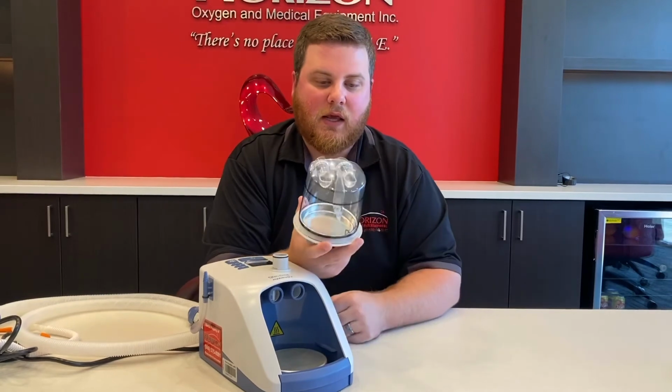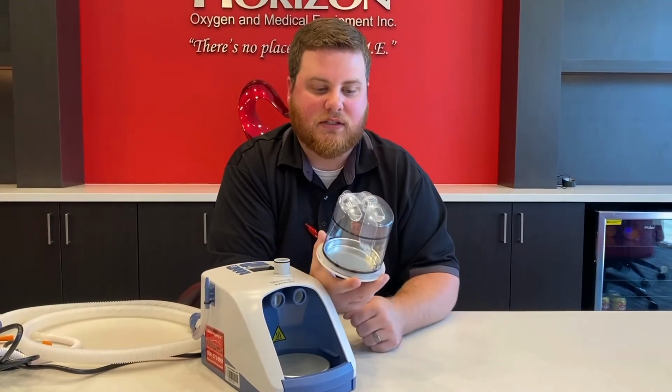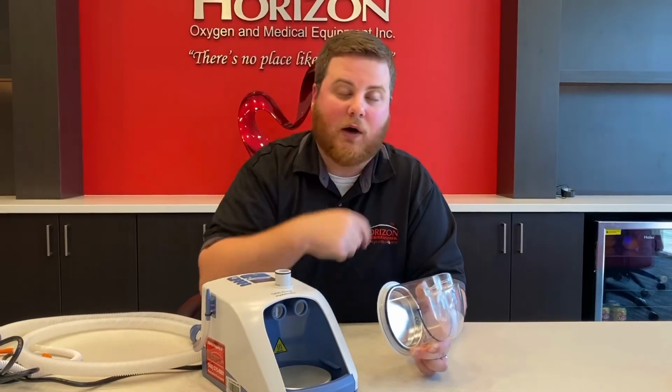Just like on any other humidifier chamber, there's a maximum fill line that's represented right here with this top black line there. And actually to add water to it's pretty simple. There's only 2 holes here. You just pour distilled water right into the top.